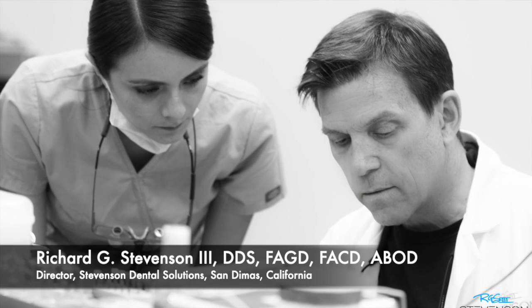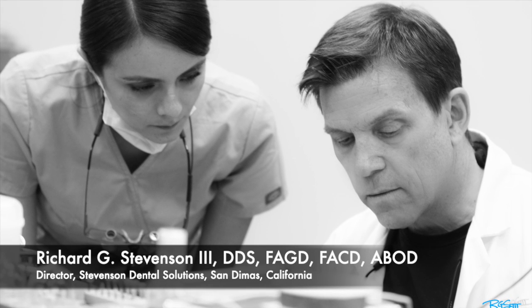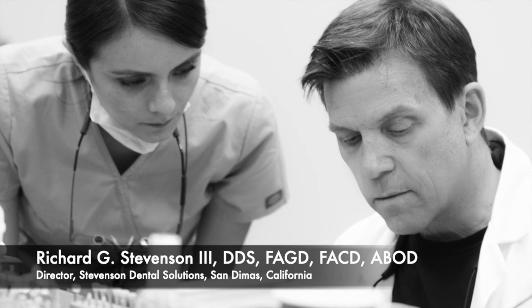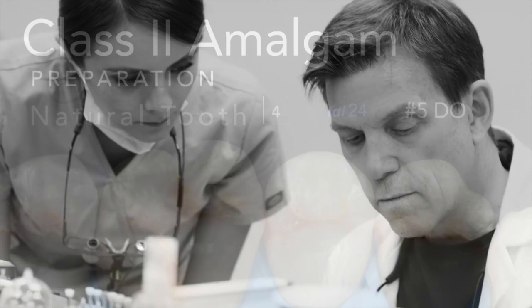Hi everybody, I'm Dr. Richard Stevenson and I am the director of Stevenson Dental Solutions in San Dimas, California. Today we're going to discuss the amalgam preparation on a natural tooth. This is going to be the first of a multiple-tooth series.